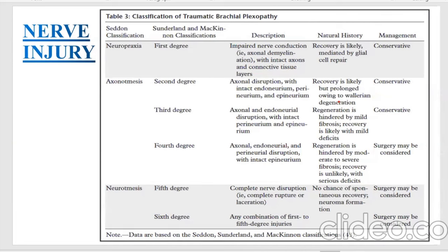Management involves conservative tissue care. In axonotmesis, Sunderland classification second, third, and fourth degree are included. In second degree, axonal disruption with intact endoneurium, perineurium, and epineurium is present. Recovery is likely to follow in the proximal to distal distribution, and management is usually conservative.